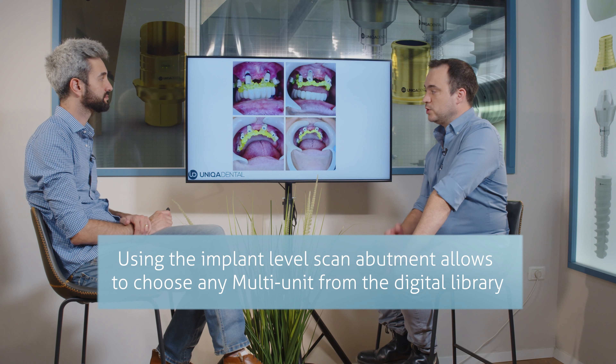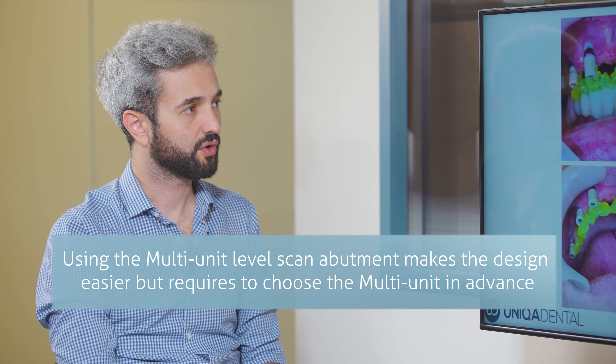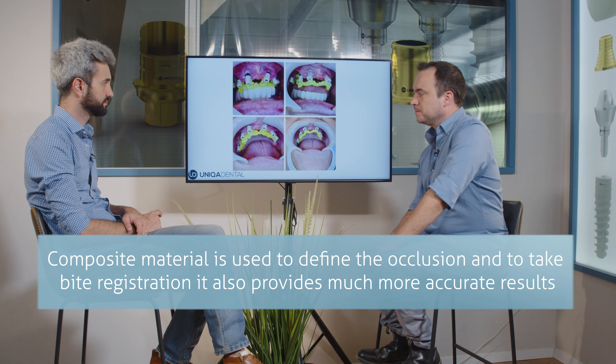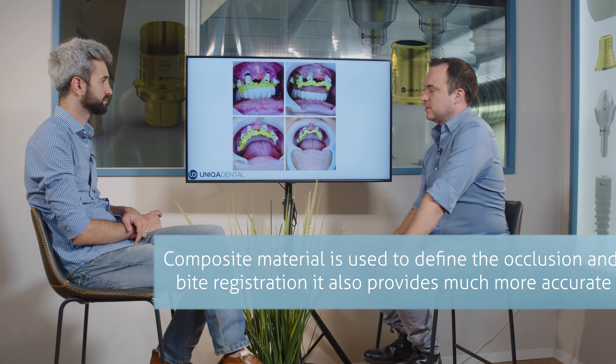And you used composite to hold and to record the occlusion? Yeah. We connected all the scan abutments with composite material — first of all to take bite registration, and second of all because the scan abutments are very tall and we want a rigid part connecting all the scan abutments so the impression will be much more accurate.